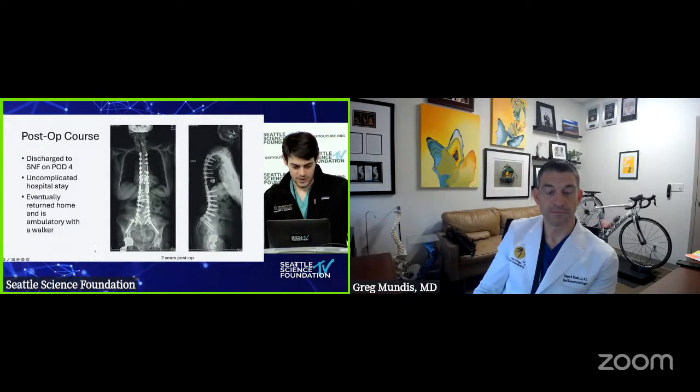And this is the postoperative course. The patient did very well, actually, in the hospital, discharged to a SNF on post-op day 4. No events during the hospital stay. Initially went to SNF, but was able to return home and return to her previous level of function, ambulatory with a cane or walker. And here are her post-op x-rays 2 years after this surgery.